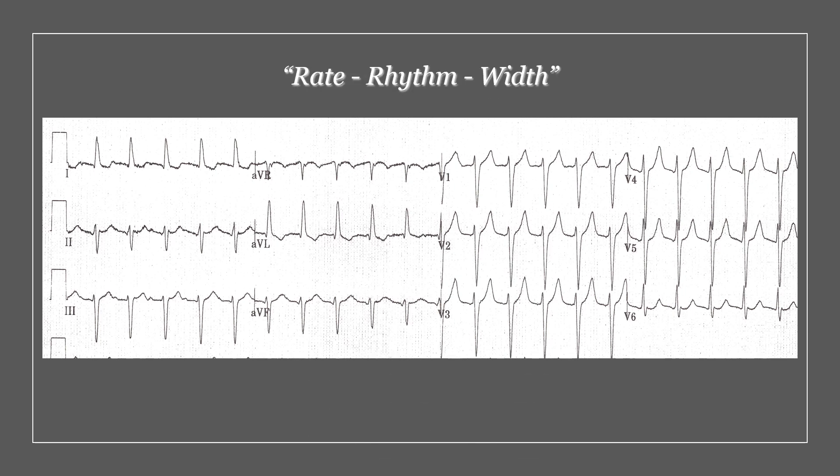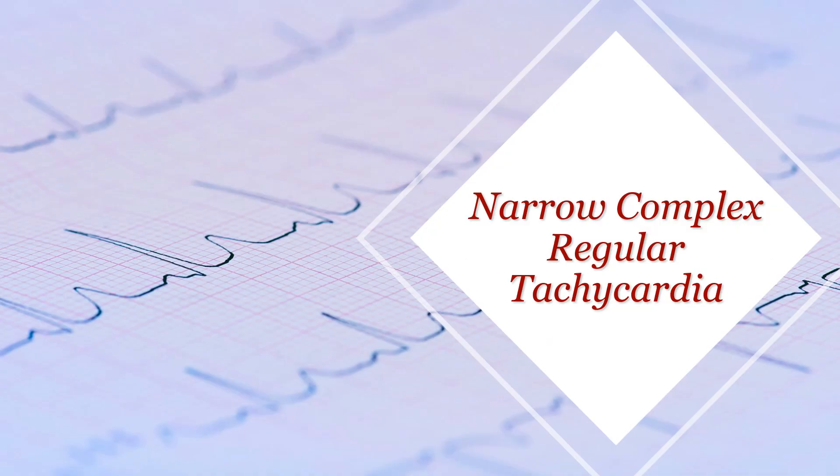Let's start with our first three questions: rate, rhythm, and width. In terms of the rate here, it was about 135 to 140 — so we are on the tachy side. In terms of the rhythm, this is a regular rhythm. And in terms of the width, that complex looks narrow. So in summary, we are dealing with a narrow complex regular tachycardia.